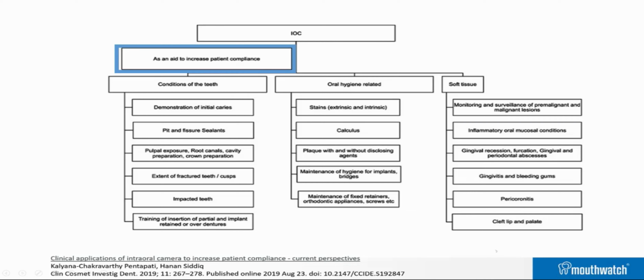Now, this chart is showing the different ways that you can use an intraoral camera to increase patient compliance, both in demonstrating need for treatment and demonstrating proper home care.